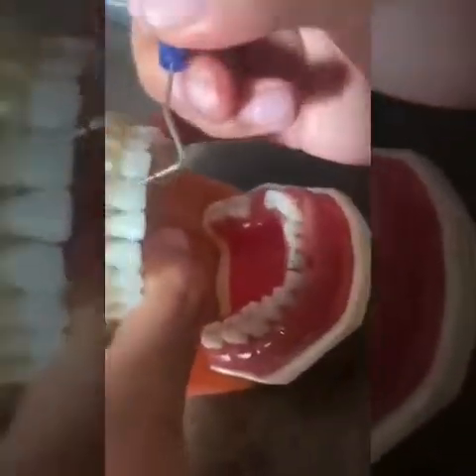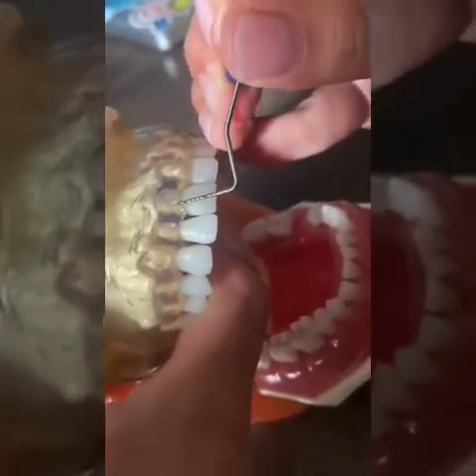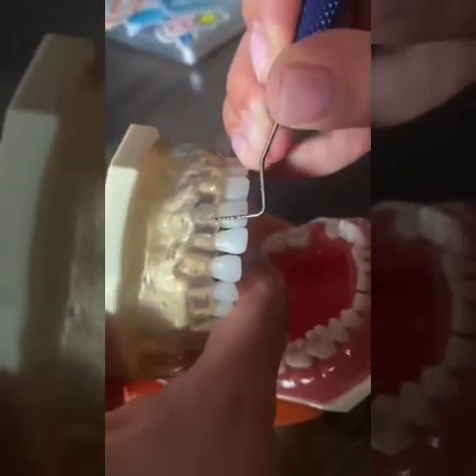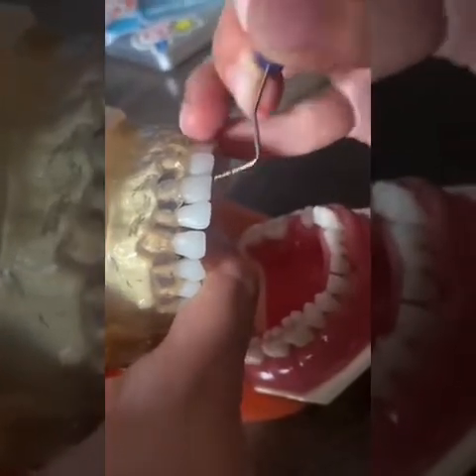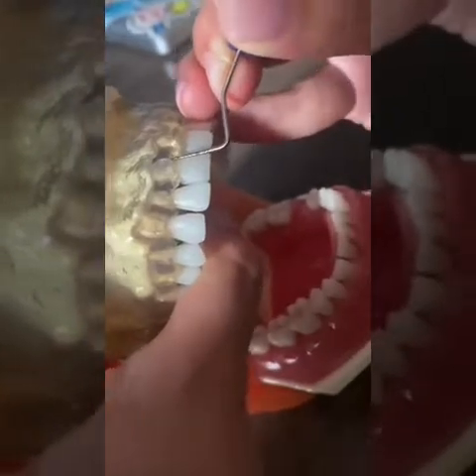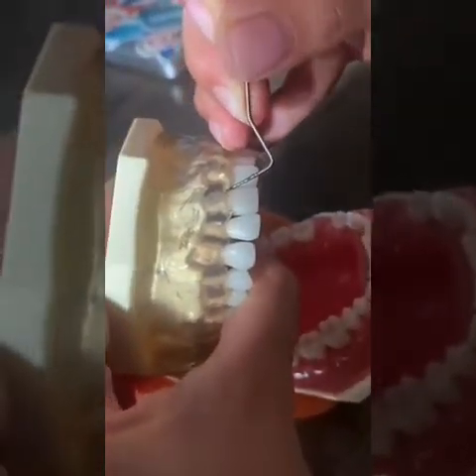So we're going to get to tooth number 8. Okay, so we're going to put the instrument at the distal line angle. We're going to tilt the instrument towards the root. We're going to walk distally into the interproximal area. We're going to tilt the instrument 10 degrees and record. Remove instrument. Again, put it in the distal line angle. Walk, mesial line angle, record. Walk, interproximal area, mesially, tilt the instrument 10 degrees and record. We're going to do this all around to tooth number 16.